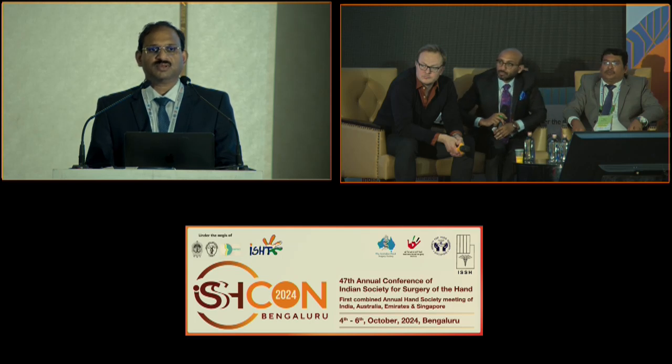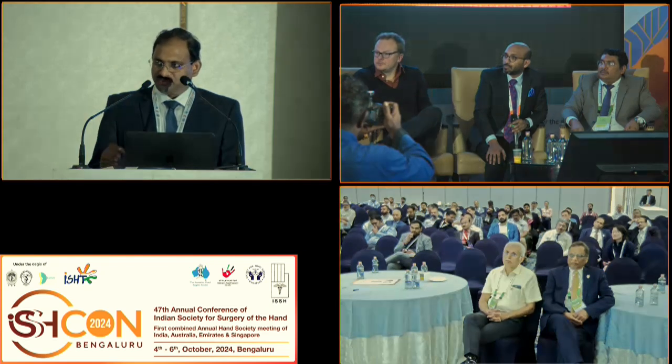For bone grafting, do you use dry scoping? Yeah, at this stage, we just stop the water flow. I do wet scopy, but at the time of bone grafting, I just stop the water flow, do suction 2-3 times, let everything dry, and then do bone grafting. And a lot of times I use glue also at the time of bone grafting.